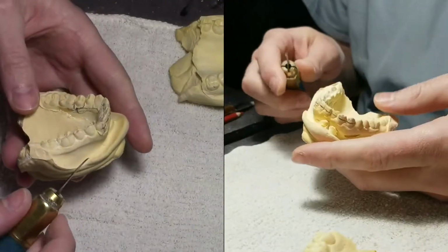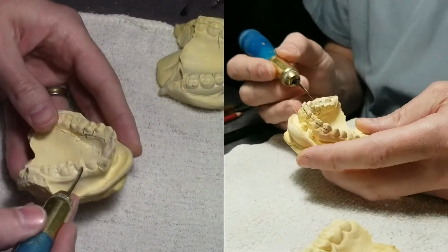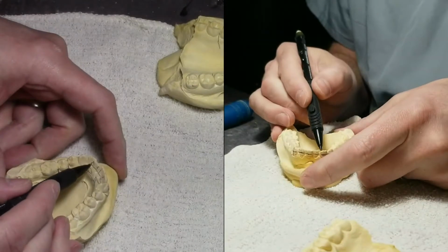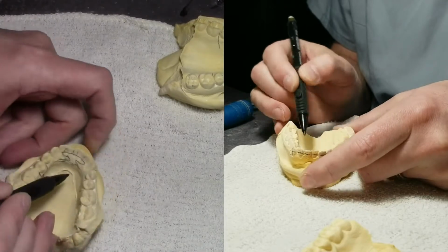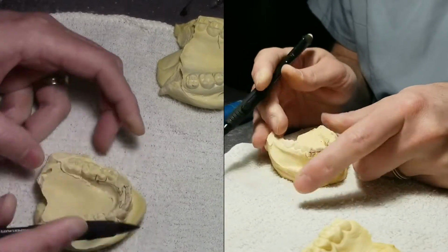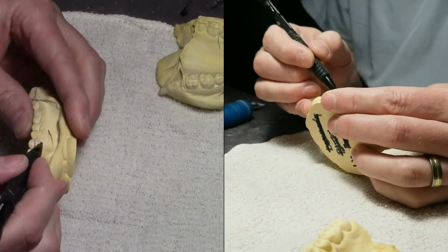Alright, so I've already pre-prepped some of this. I've picked the bubbles off the occlusion so I could put them together pretty easily. I've already drawn out my wires, and I know it's a jumbled mess what you're seeing here, but hopefully you'll be able to. I won't video, maybe I'll video bending this, I don't know. It takes so long for me to bend this. So I've already got my labial bow drawn.